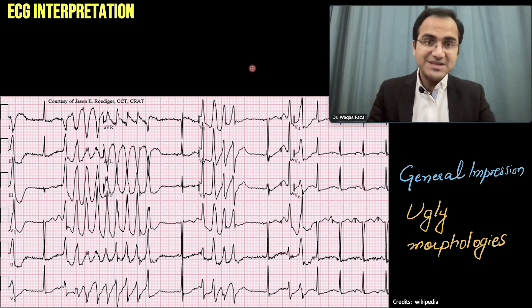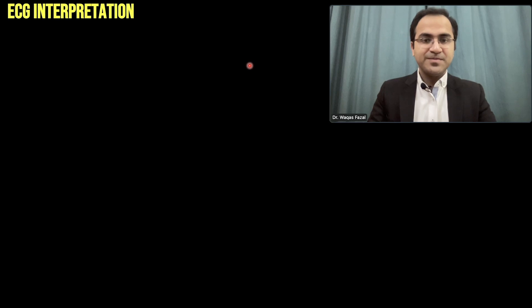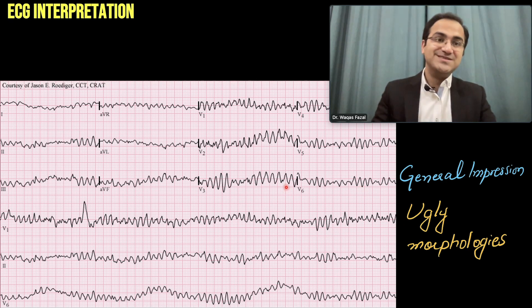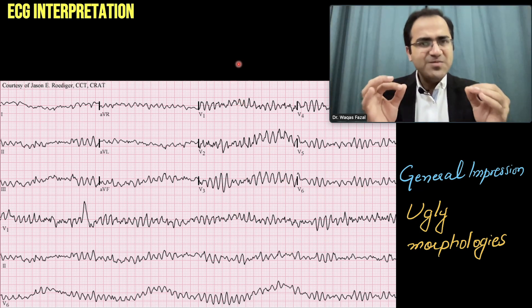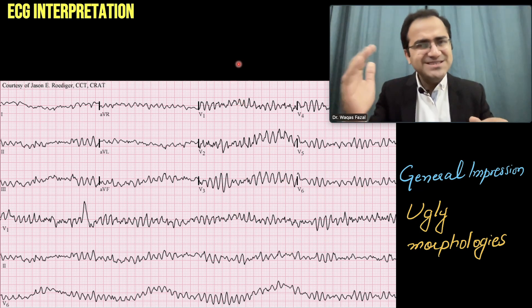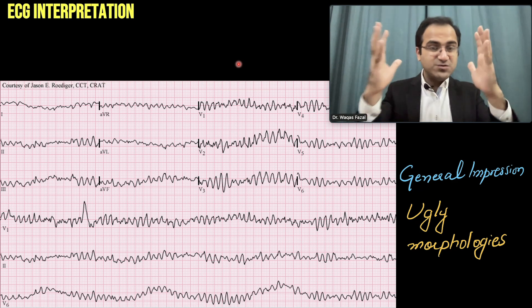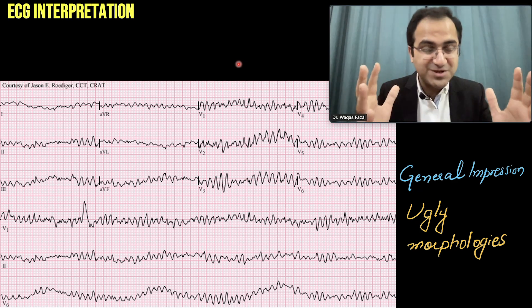Moving on to the next ECG: the first-glance impression about this ECG is that it is also showing ugly morphologies. So the first impression is very important. The first step in ECG interpretation is your general impression — whether it is very fast, very slow, or there are ugly morphologies present.